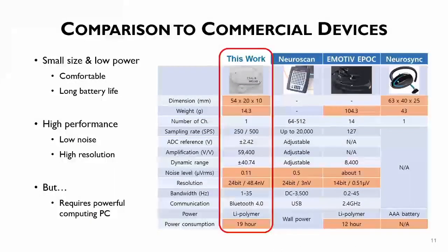This previously developed device can be compared with commercial products. It has a small size with low power and is very comfortable to use, and it has high performance in terms of low noise and high resolution for SSVEP sampling. But we are not satisfied with the requirement of a powerful computing PC.